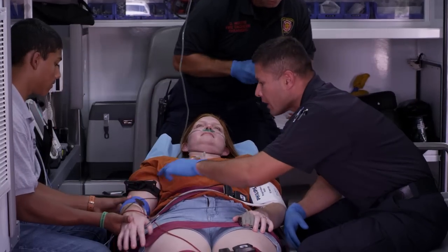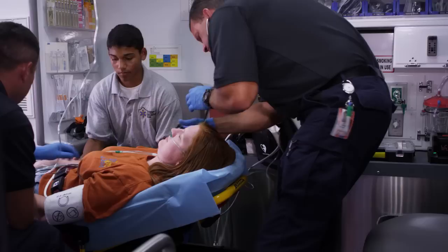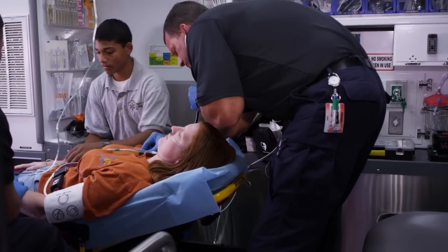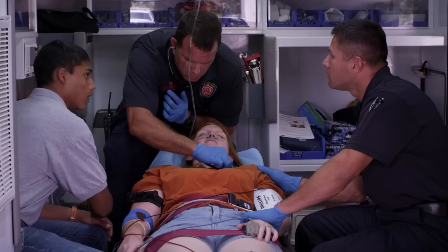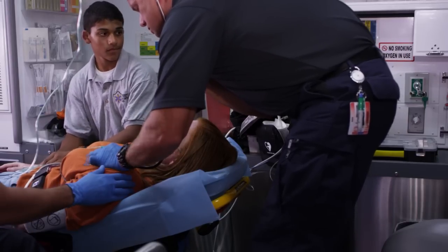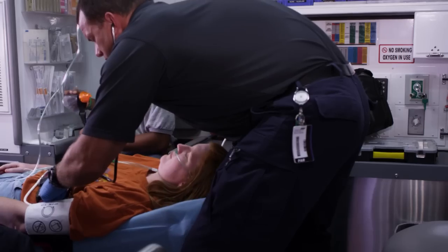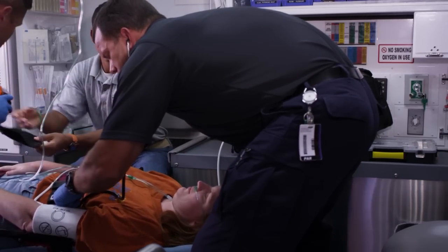The bleeding seems to be under control. Okay, looks like we have it under control with the tourniquet. Go ahead and let's get another blood pressure on her. Yvette, how are you feeling? Okay. 77 over 40. She's pretty hypotensive. She's feeling pretty tachycardic. Just get a Trendelenburg when you're done there, Damon.